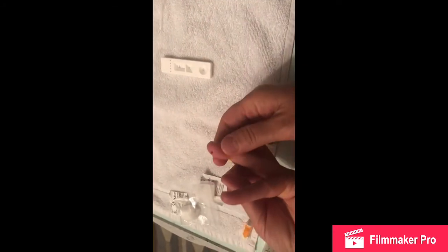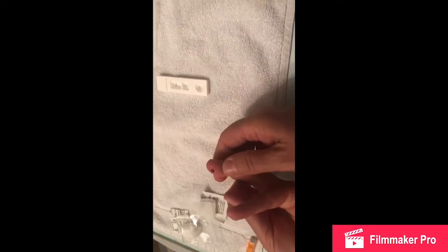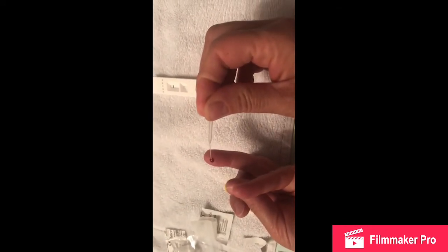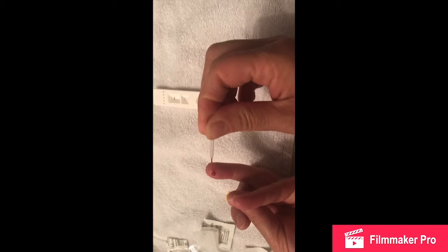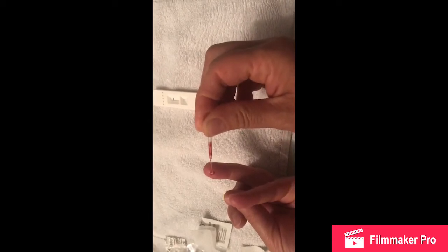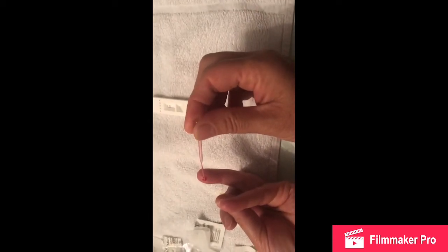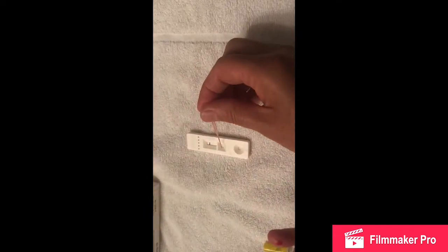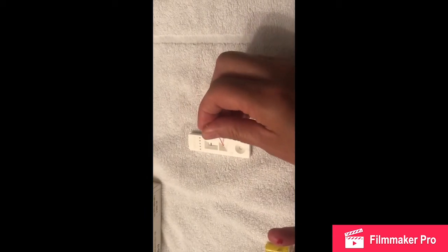Okay, drop that. Now we've got — I'm not sure what this is called — but as you can see, this will suck up the blood inside it. That's it. And then we'll drop it on there.